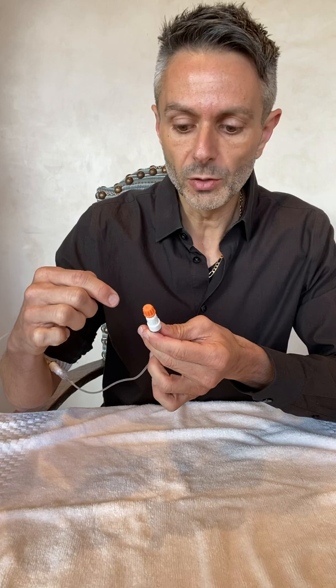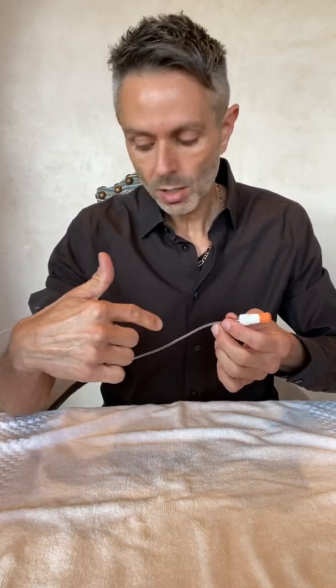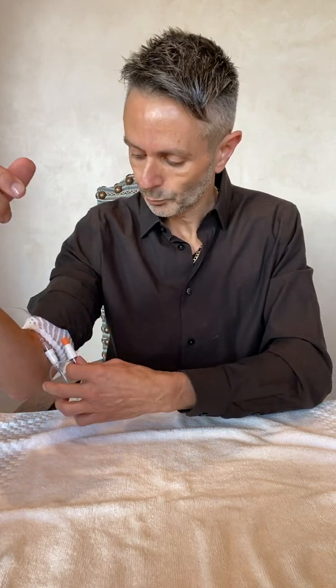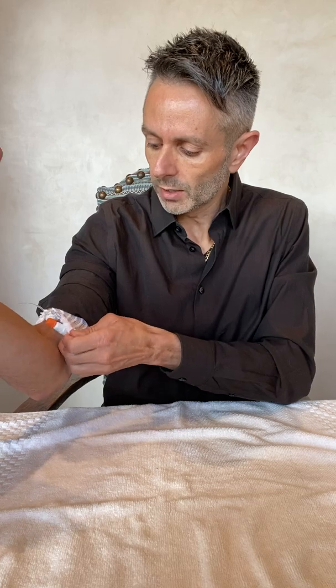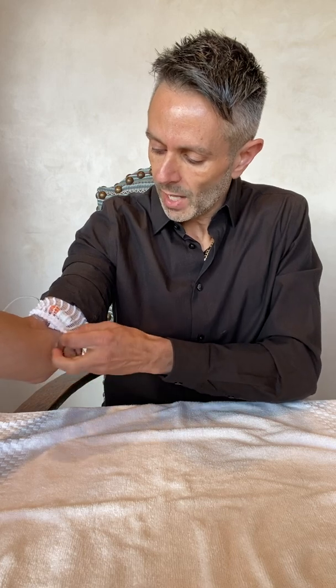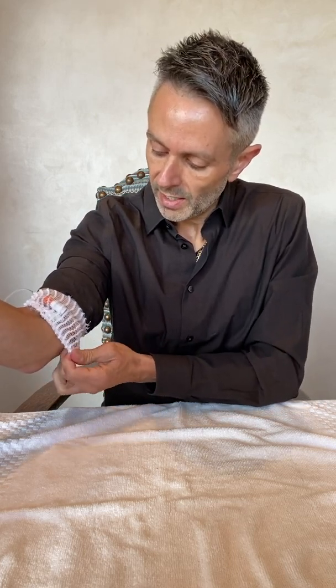I have an extension added onto my PICC line which allows me to do this myself. If you have an extension as well, make sure your line is safe and secure. I roll it up like this and tuck it into a gauze — I call it a gauze sock — and make sure there's no tubing hanging out, because you don't want it to get snagged on anything and pull your PICC line out. Get it all nice and secure in there, and you can even put your shirt over it and no one will know it's there. I think you're going to do great with this — good luck!